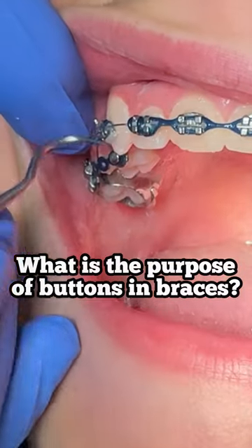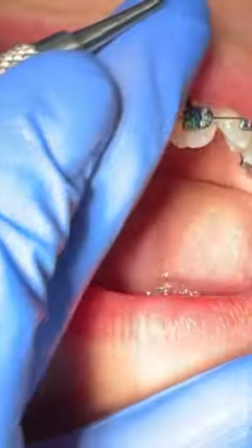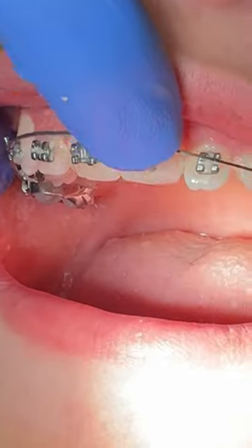Hi everybody, Dr. Williams here. In this patient we have a palatally placed tooth and we need to get it into the arch. What we had to do was get an attachment on it so that we can move the tooth.